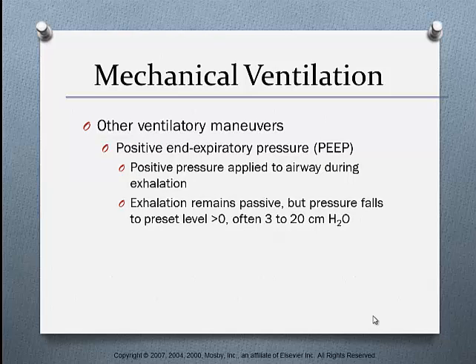We also have what's called PEEP, the positive end expiratory pressure. This maintains or improves oxygenation while limiting the risk of oxygen toxicity. The goal is to decrease the FiO2. Positive pressure is applied to the airway during exhalation. The lung volume is higher during exhale than normal, and there's an increase in aeration of the alveoli. It's used in lungs with diffuse disease, severe hypoxemia, or loss of compliance or stiffness of the lungs.